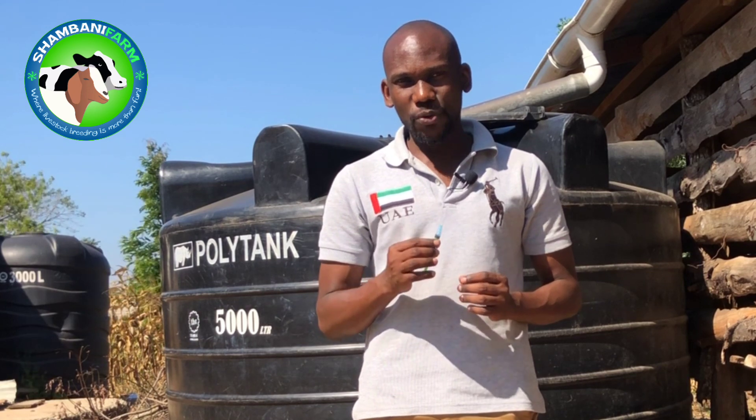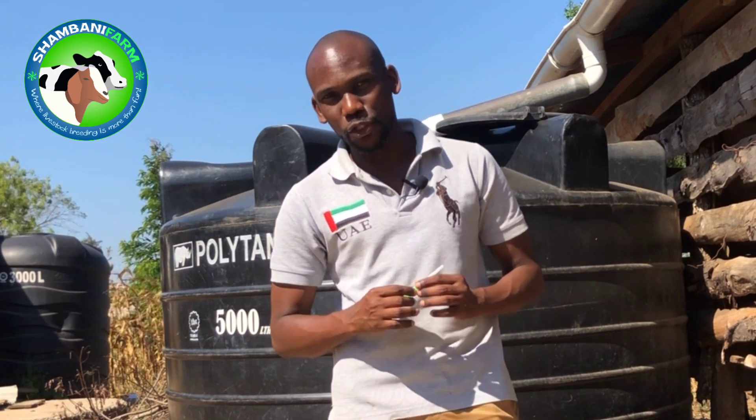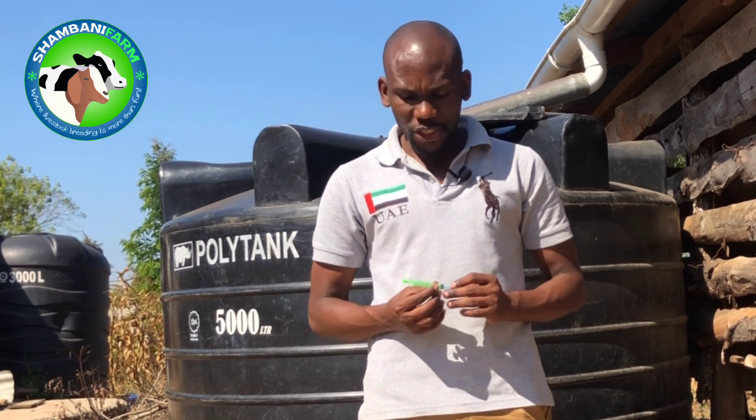We're going to demonstrate how to administer a subcutaneous injection on a goat and show you the few things that you will need to administer this injection. The first thing you will need is a syringe.